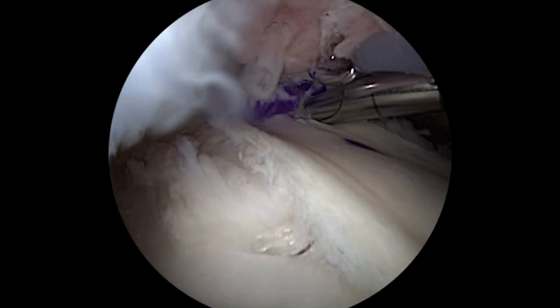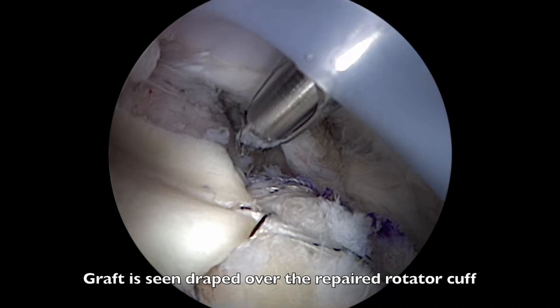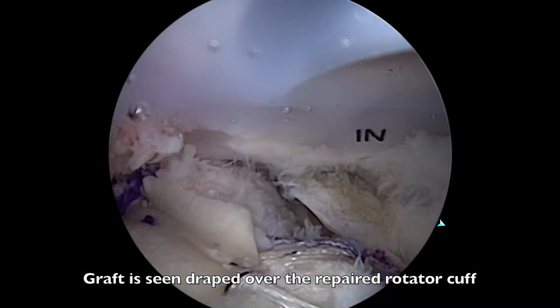The final images here now show the graft nicely draped over the repaired rotator cuff tendons to add biological healing to the rotator cuff repair.